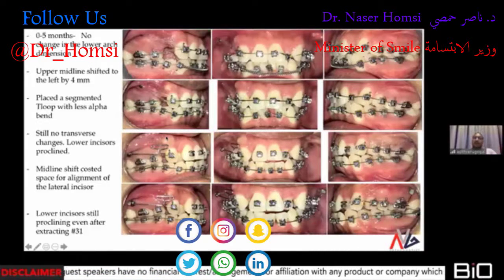But as you can see, 5 months passed and absolutely nothing changed. I was not able to move the canine a bit. I did not get any kind of intercanine or intermolar width increase or anything, although that was unstable, but still I had to expand. I placed this open coil spring over here as well to get some lip bumper effect, but nothing helped. I was expecting a lot of change, considering the fact that the previous patient that you'd seen had tremendous results. But this case was showing nothing.